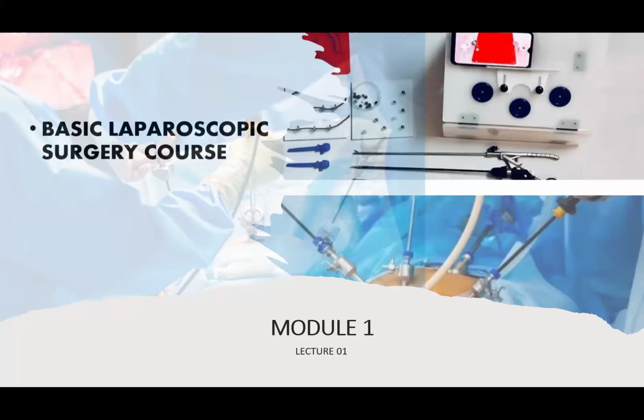There are about 10 modules that come with endo trainers, which improve dexterity and proficiency during your actual laparoscopic training practice, because many publications have shown that most of the laparoscopic surgeons that were involved in a lot of training in the dry lab have better proficiency than those who just go straight ahead on live patients.